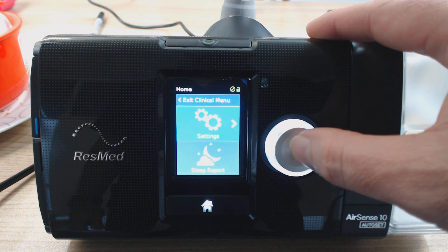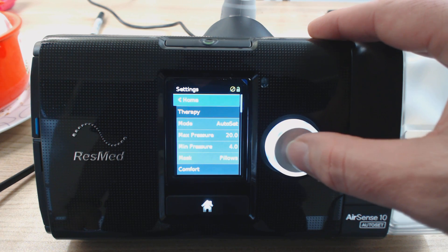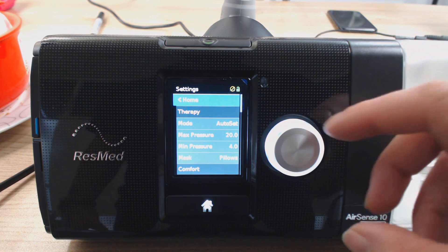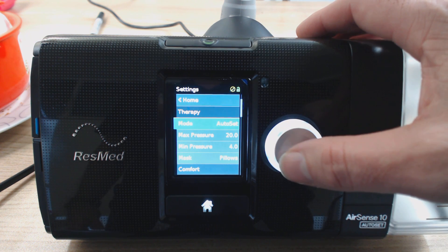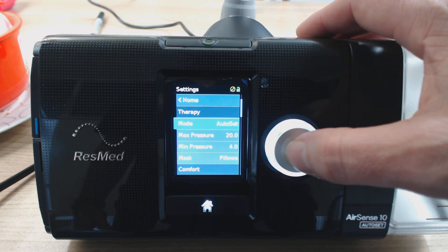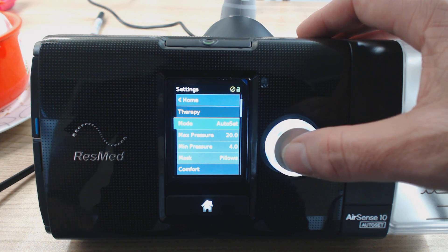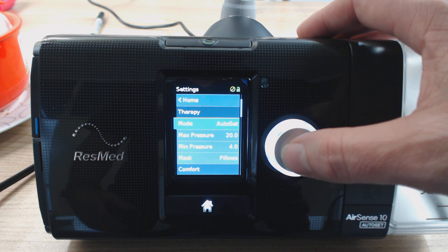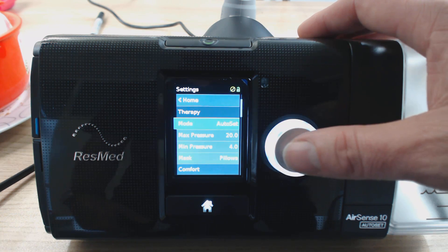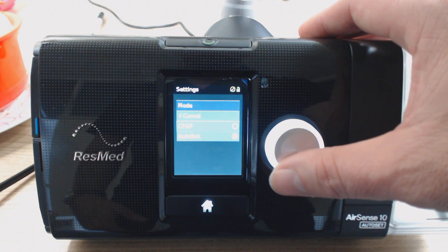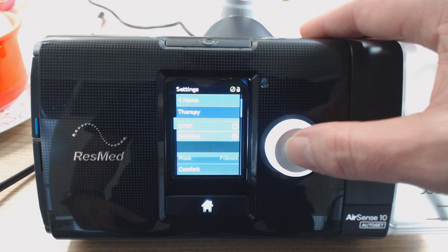Now when we click these settings, they're going to be a little bit different to what they said in part two. Let's just go through some of them. The first one is the mode, and it says AutoSet. If you have an AutoSet machine, I suggest you run in AutoSet. If you have a fixed pressure machine, it's probably only going to have the fixed pressure mode. But if you've got the AutoSet one, you can go between CPAP and AutoSet. So we're just going to keep it on AutoSet.